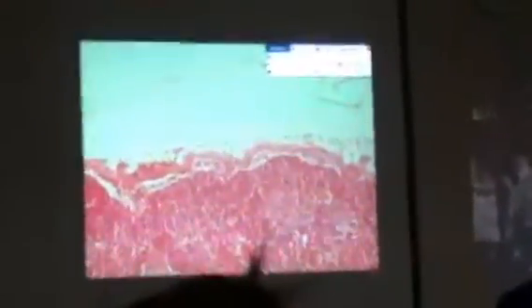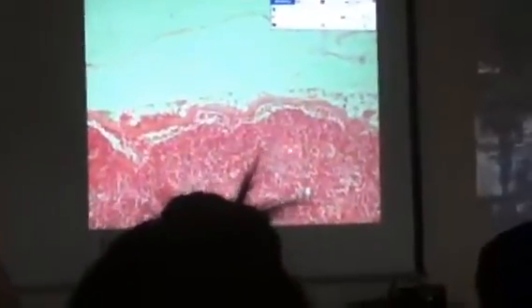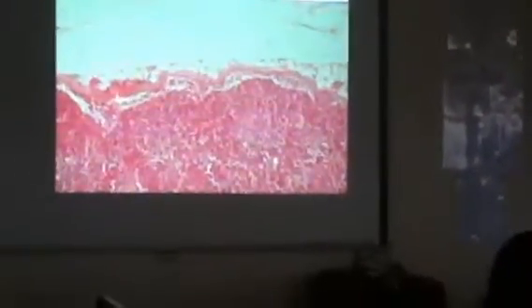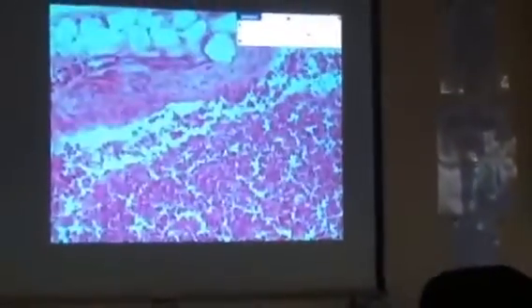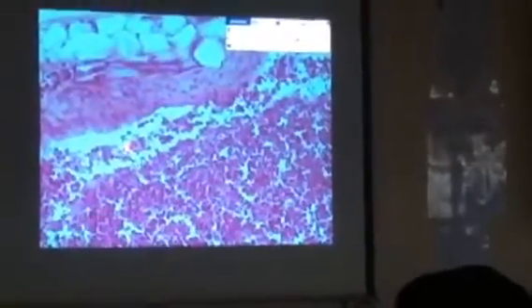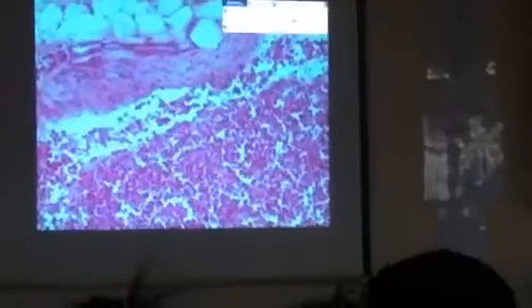Now, the majority of the areas of the lymph nodes are composed of lymphocytes. As mentioned a while ago, the pointed cells are the lymphocytes. However, present in the sinuses is another type of white blood cell. What are the cells present in the sinuses of the lymph nodes? The macrophages in the lymph nodes, which are specifically called histiocytes.